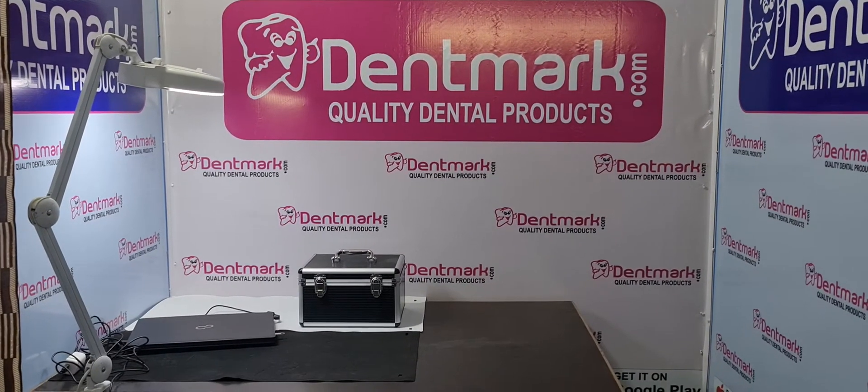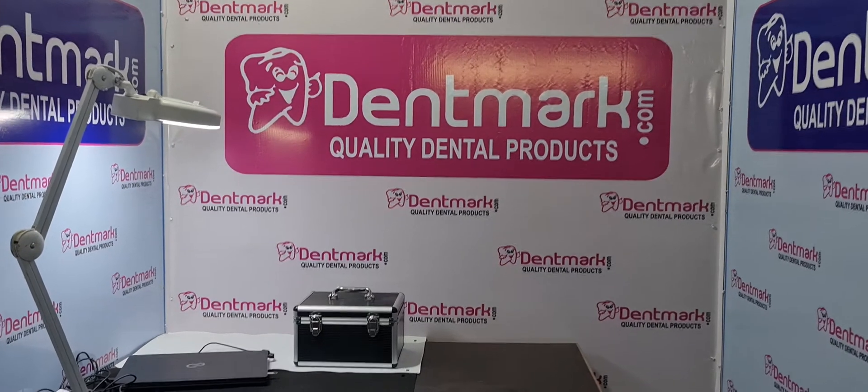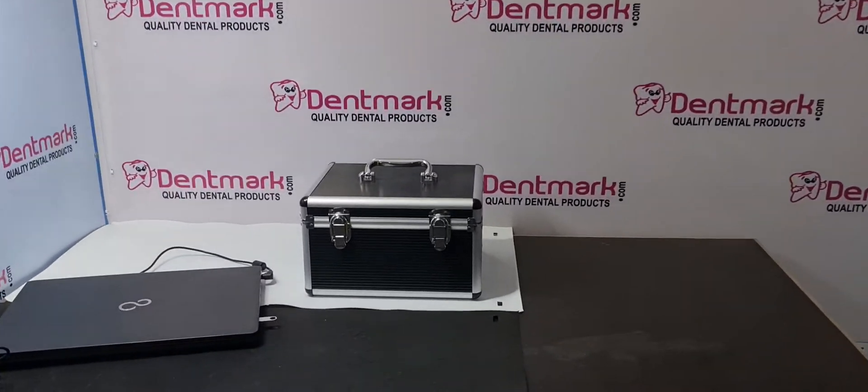Hello friends, Dentmark now have another product: portable dental x-ray. I will give you the demo of this and tell you the specification and how to use it.